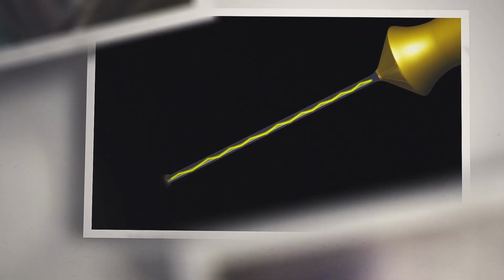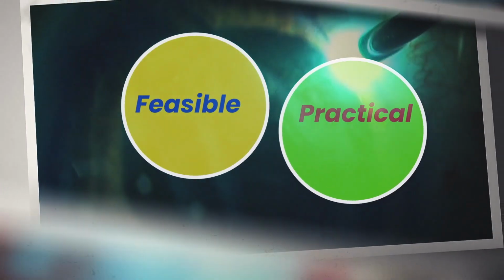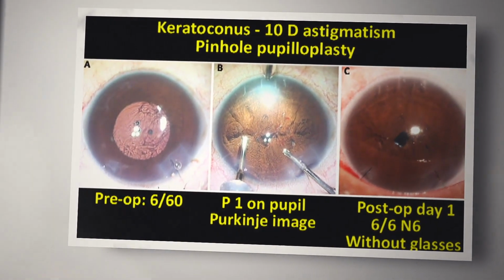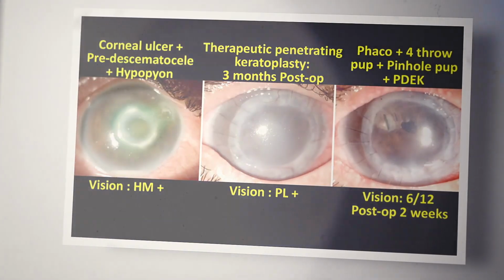The endo-illuminator aided modified approach to such cases is highly feasible, practical and convenient. It can serve as a smart addition to our surgical armamentarium, as patients with concomitant pathology can still get good post-operative vision with this modified technique, helping achieve better results both intra and post-operatively.